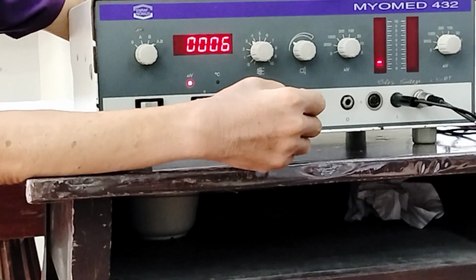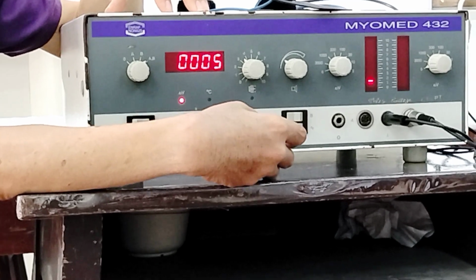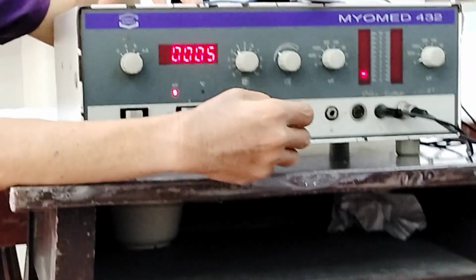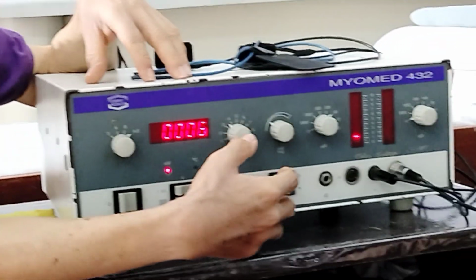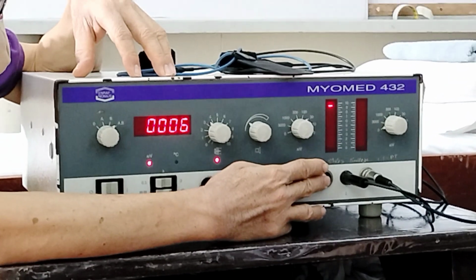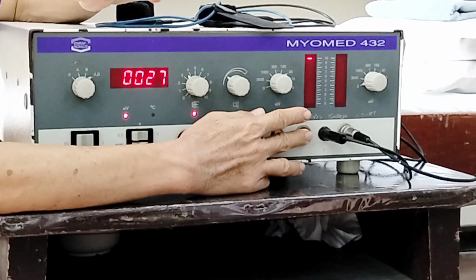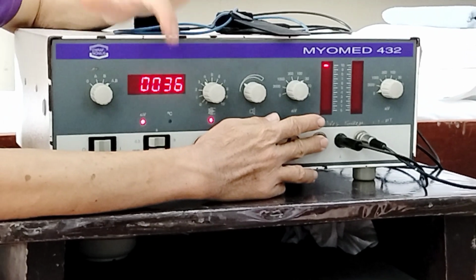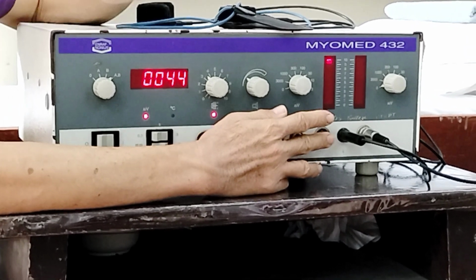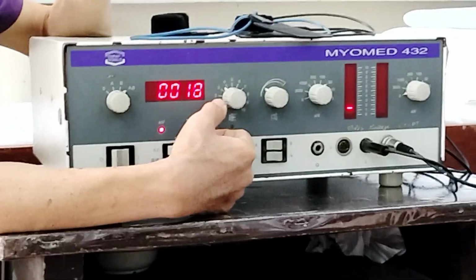Okay? So next, if you're going to place this to 3 seconds, there will be changes in the signal every 3 seconds. So for that, 1, 2, 3, it will change. 1, 2, 3, it will change again. So the signal takes a long time to change there.